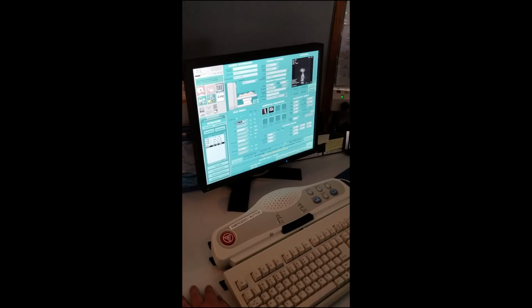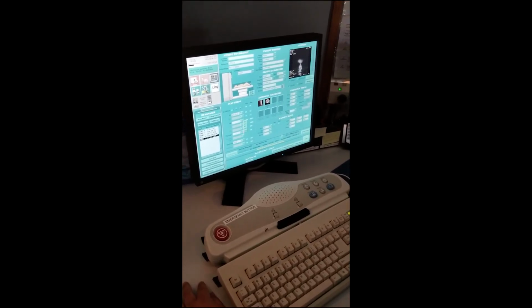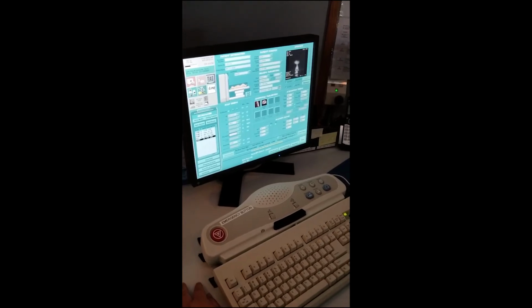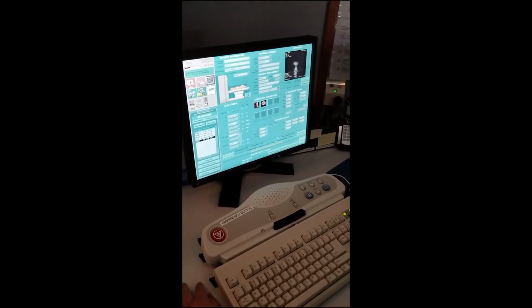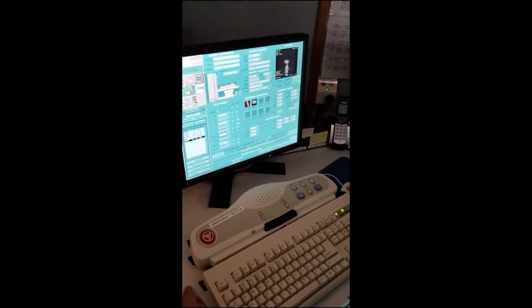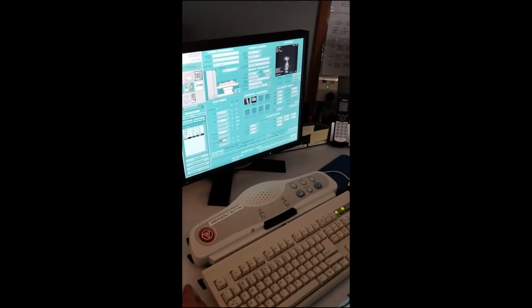And then on that one, I don't know how much you need. So put 400. Let's start with 400, because we know 400 is the lowest we want to be. And then flip angle of 25.